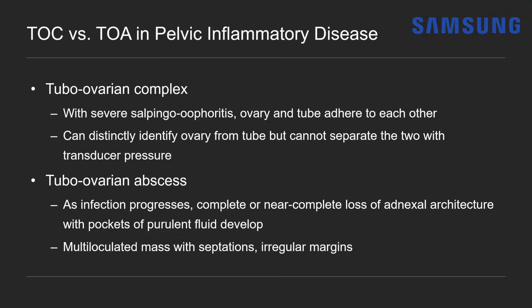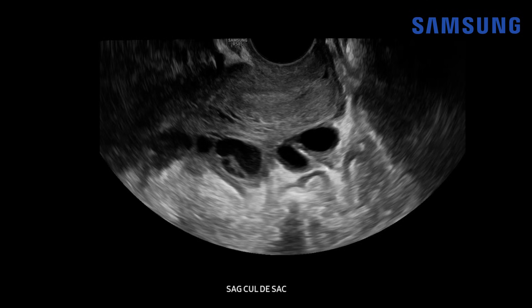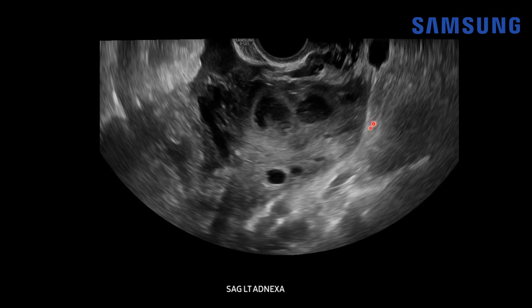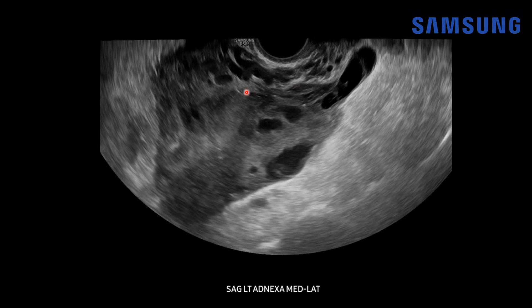Let's look at the final case — a patient in her 20s presenting to the ED with pelvic pain, nausea, vomiting, and elevated white count. On a transvaginal image of the cul-de-sac, we see the cervix with the external os and endocervical canal, and posterior to that a dilated fluid-filled tubular structure with wall thickening and debris. Moving sagittal into the left adnexa, an inflammatory mass appears, with pockets of heterogeneously echogenic debris and no identifiable normal ovarian architecture.